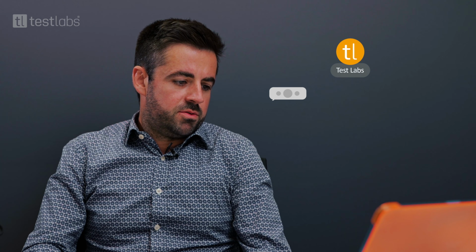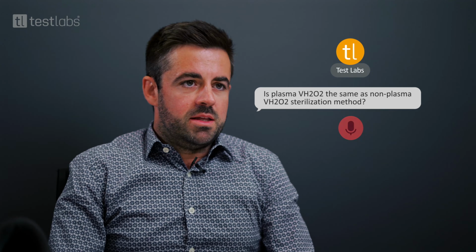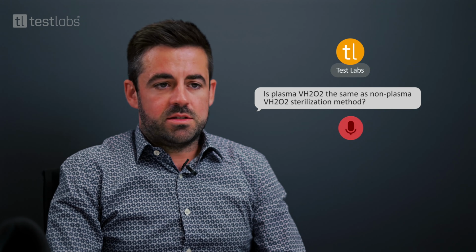Is plasma VH2O2 the same as non-plasma VH2O2 sterilization method? In the sterilization, they are similar. It's a low temperature, gaseous process that uses H2O2 as a sterilant. From the sterilization point of view, this is the same process. Now, as with any other sterilization modality, particular attention has to be paid to biocompatibility after the process and to toxicological results, or let's say the profile of the sterilant residual left after the sterilization.